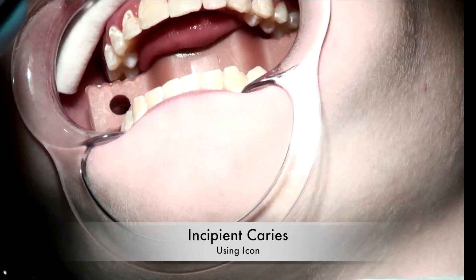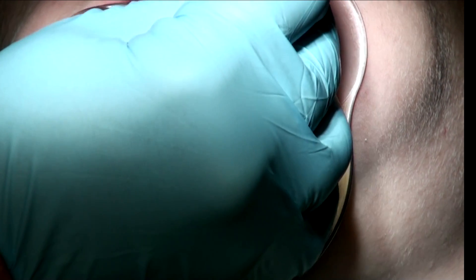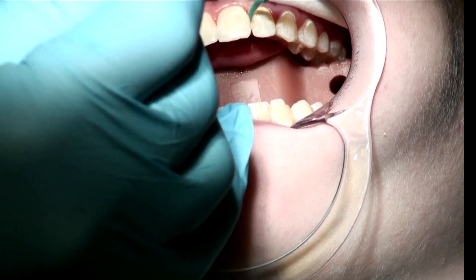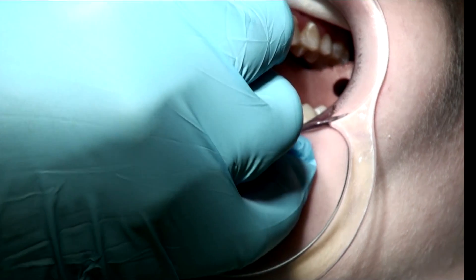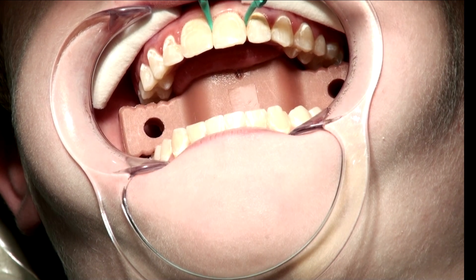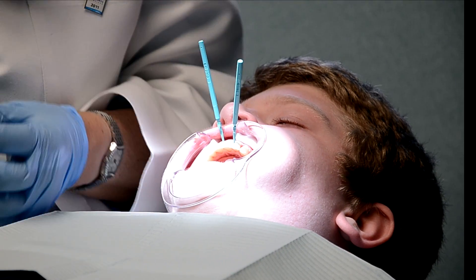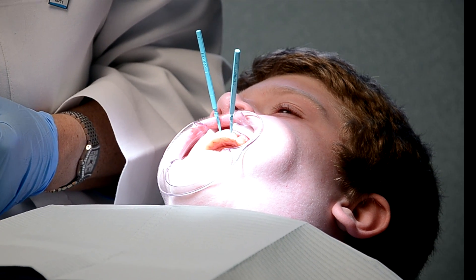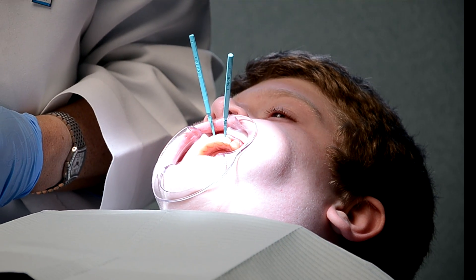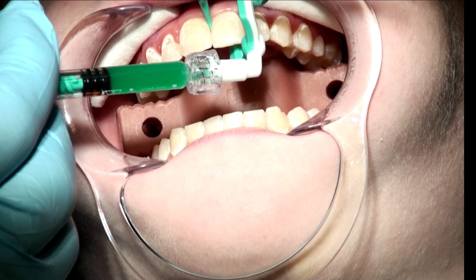Jason, the first thing we're going to do is place some wedges between your teeth. These are custom wedges designed by Icon, and they're used to separate your teeth ever so slightly. The second thing we're going to do is take 15% hydrochloric acid, which is an etch solution, and this etch solution is going to be placed interproximally with a special delivery system.